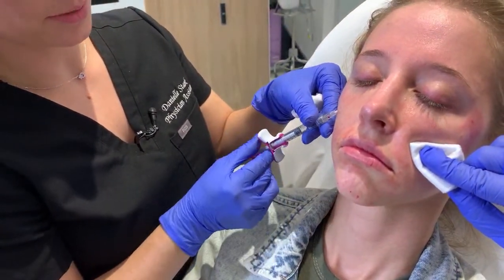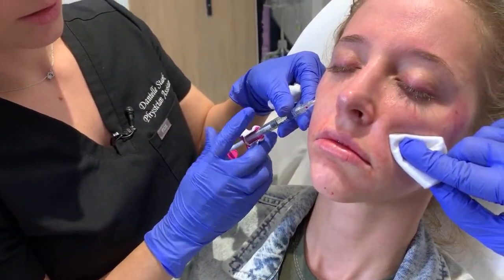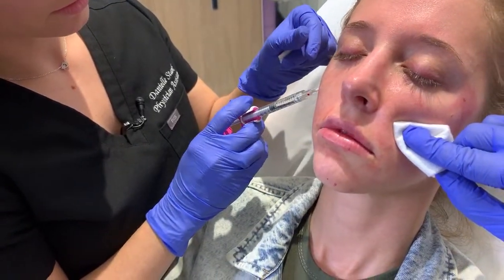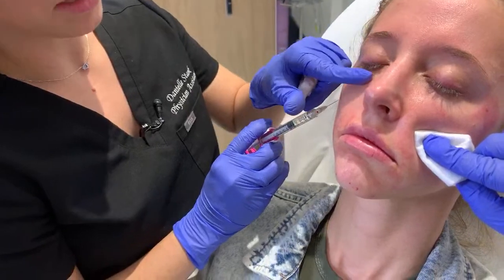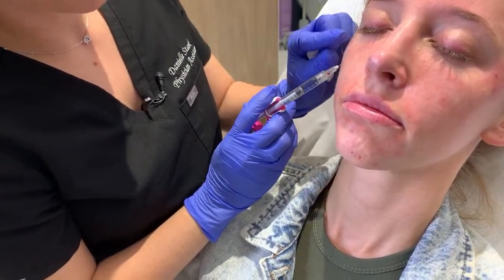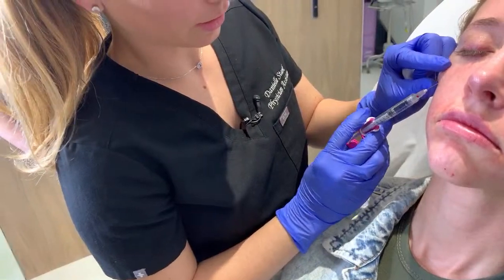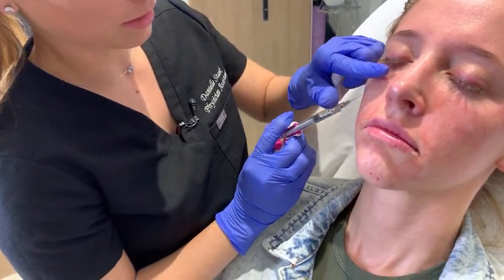Under eye fillers are something that people tend to be super nervous about, and they shouldn't be. What does a cannula feel like? Does that hurt? It feels like a lot of pressure, but not a lot of pain. When I had cannula under my eyes, I honestly didn't even feel it. I barely felt it moving. It just depends. Look up for me. You can feel it a little more if you're on the bone. I think it just depends too, like if you're at a more sensitive time period and things like that.